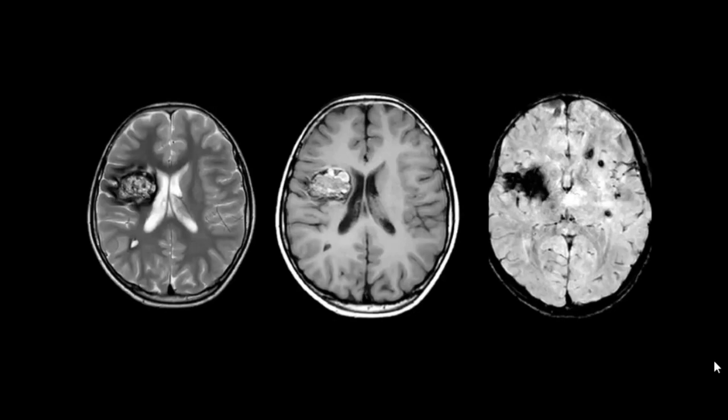Ma'am, these are images of an MRI brain which you have provided to me. First is T2 weighted, second is T1 weighted, and third is GRE images. I can appreciate a well-defined lobulated abnormal intensity lesion in the right parietal region, predominantly involving the white matter, and it is also extending into the cortex.